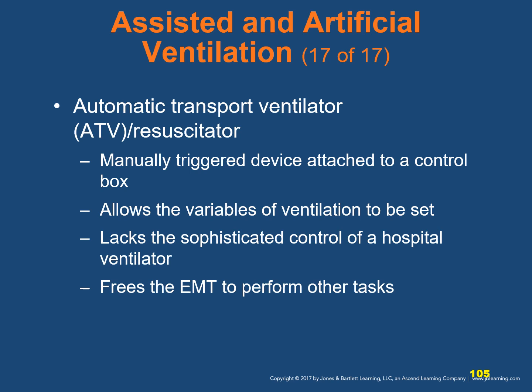Most models have adjustments for respiratory rate and tidal volume. The estimated tidal volume should be 6 to 7 milliliters per kilogram. The pressure relief valve may lead to hypoventilation in patients with poor lung compliance, which is the ability of alveoli to expand when air is drawn in during inhalation, increased airway resistance, or airway obstruction. Constant reassessment of the patient is necessary. So assess for full chest recoil.